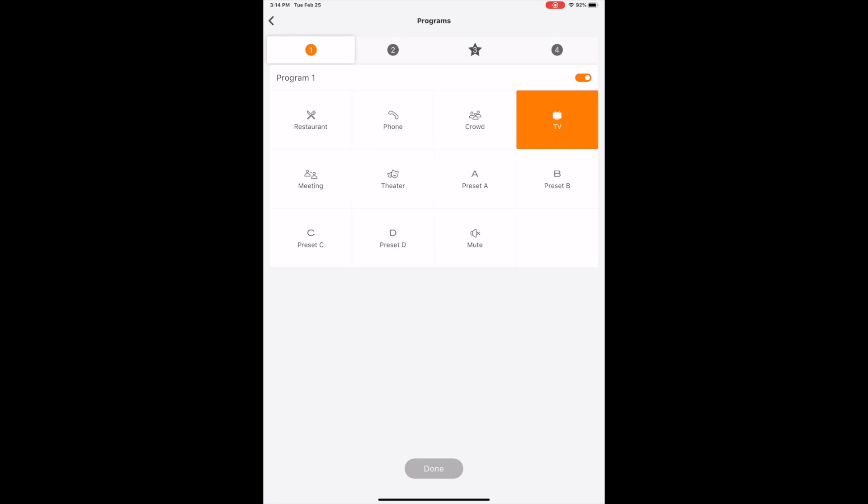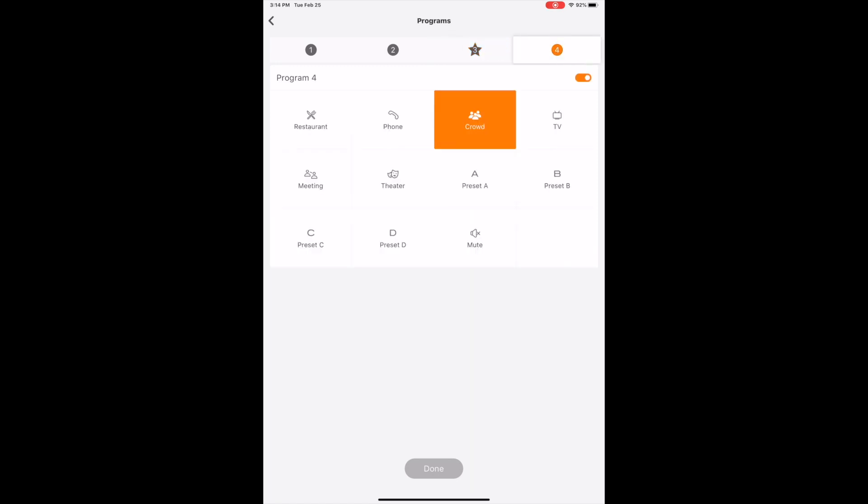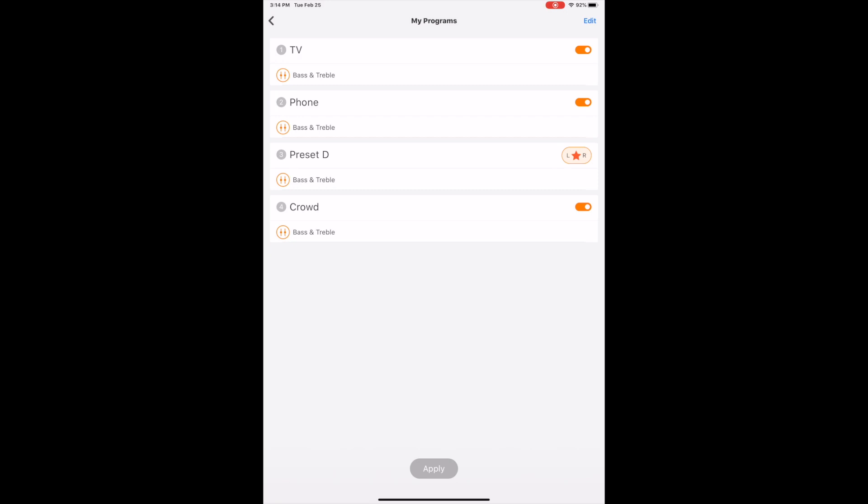So it's really cool that you can go through and you can set these. We go into program two, I have it set for phone. Program three I went with the preset D which was something that I had already worked with and then I made adjustments. And then program four's for crowd. What that really does is take out some of the highs and levels the sound out just a little bit more to make it easier to discern certain sounds like particular people's voices.